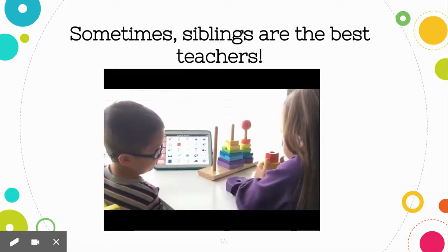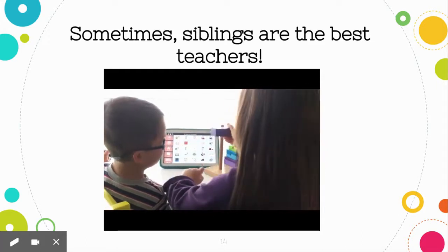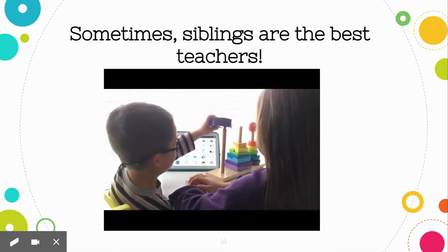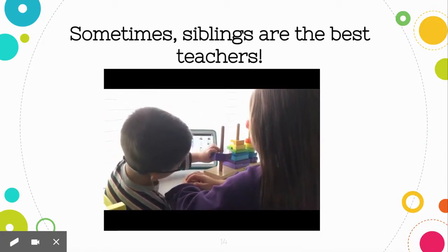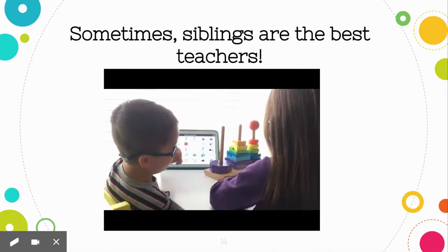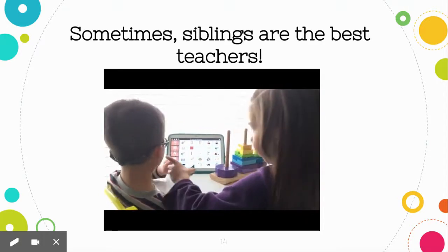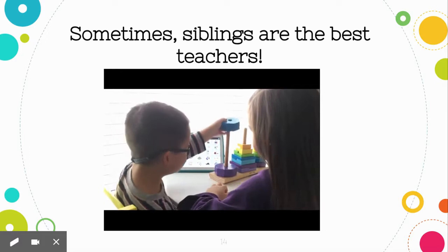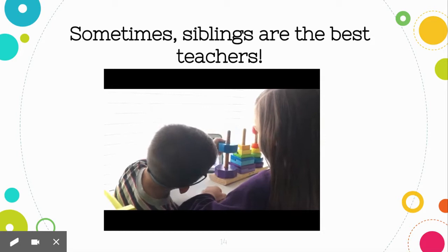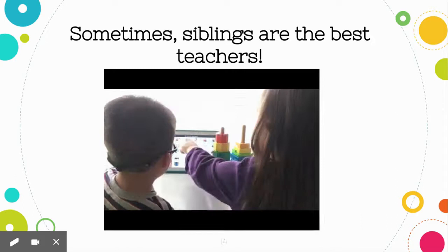Let's put purple on the bottom. Can you put it? Now let's put blue on top of the purple. Good, now let's put green.